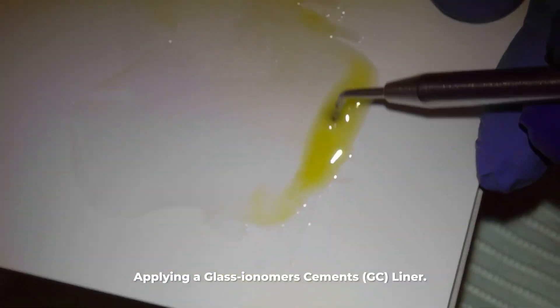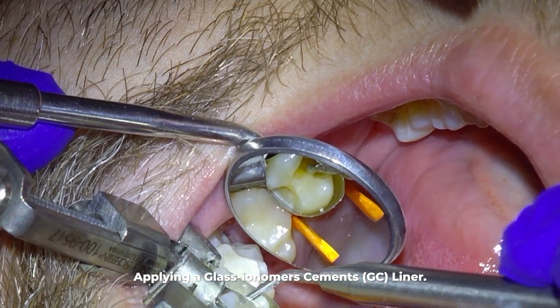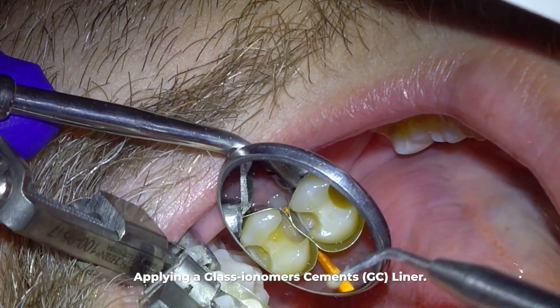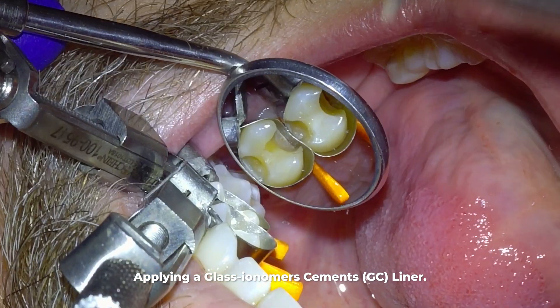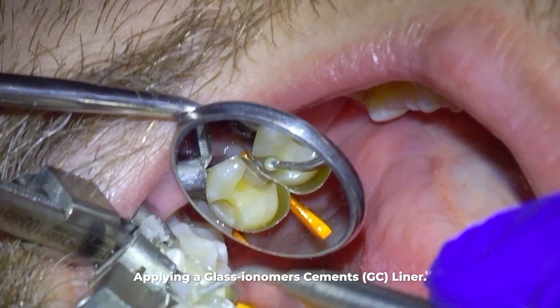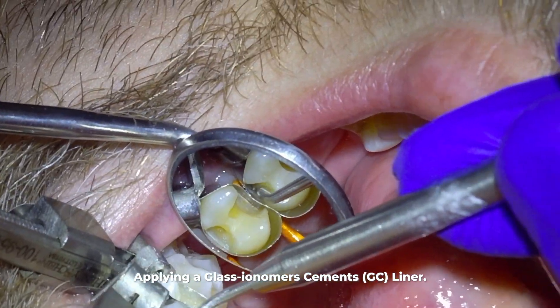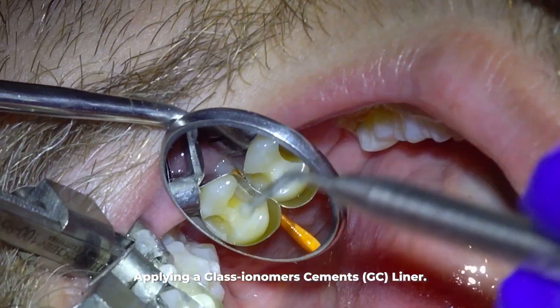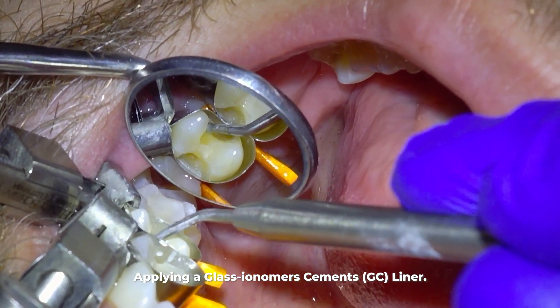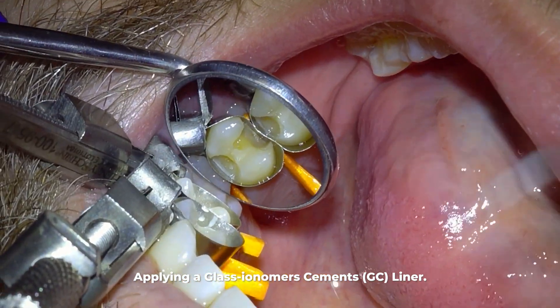This next step is the most critical part of everything I do during the filling. I'm going to apply GC liner. The main reason is that it reduces sensitivity in a couple of ways. Dental schools teach applying liner on deep cavities because of its anti-sensitivity properties, but I do it on almost every filling because sometimes even shallow cavities cause sensitivity. Once I started placing GC liner on every filling, I went from rarely having patients with sensitive teeth after a filling to almost never having a patient with sensitivity.